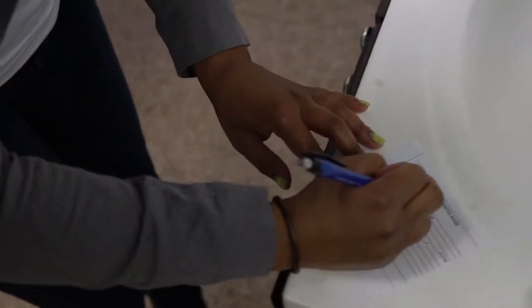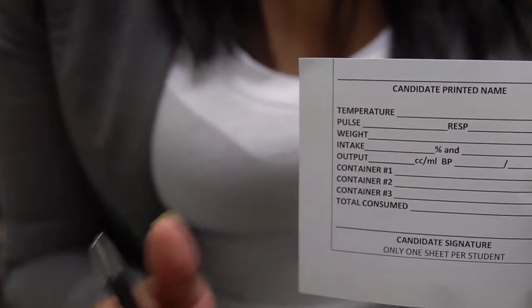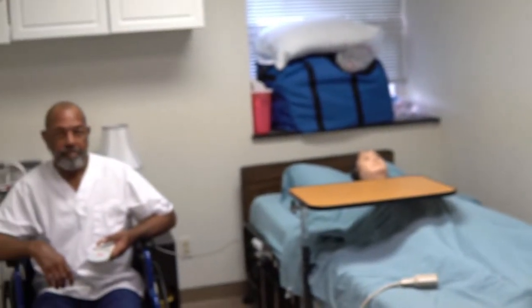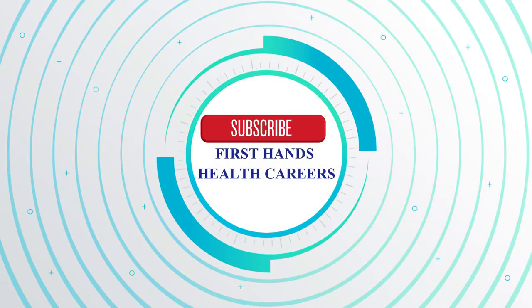Then you always want to record your finding on a candidate recording sheet. You write your weight in the area where it says weight, and then you always remember to sign your form. And then you end your skill at that point. Mr. Bailey is safe and has his call light. That's how you weigh an ambulatory resident. Thank you for tuning in to First Hands Health Careers YouTube Skills Channel. Remember, thumbs up, no thumbs down.